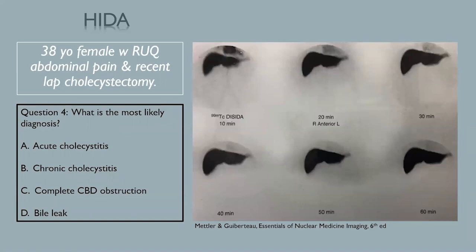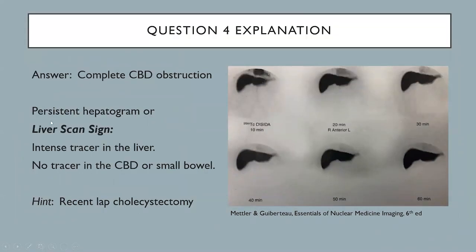This is a 38-year-old female with right upper quadrant abdominal pain and recent laparoscopic cholecystectomy. There is intense radiotracer activity in the liver parenchyma but no significant excretion of activity into the biliary ducts and into the small bowel even up to 60 minutes of imaging. This is the persistent hepatogram or liver scan sign — intense tracer activity in the liver and no tracer in the common bile duct or small bowel, likely due to high-grade or complete common bile duct obstruction.